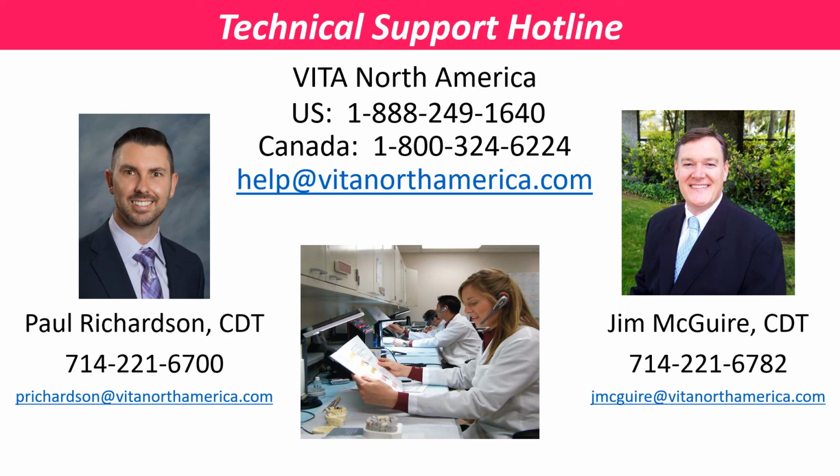Do I prefer a water or liquid base stain for zirconia? The stain liquid, or the effect liquid I was showing earlier, is actually a water-based liquid. Is that what you were asking? It's not an acidic-based one, so it's a little bit nicer, and it works pretty well. If that wasn't your question, let me know or call me and we can talk about it.